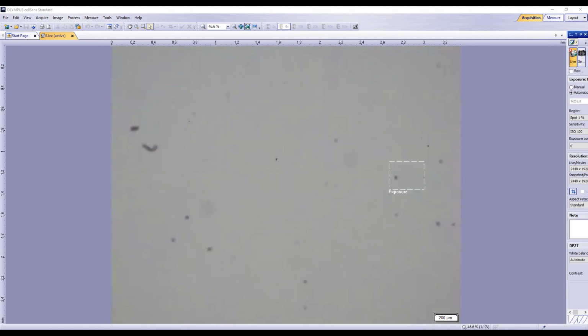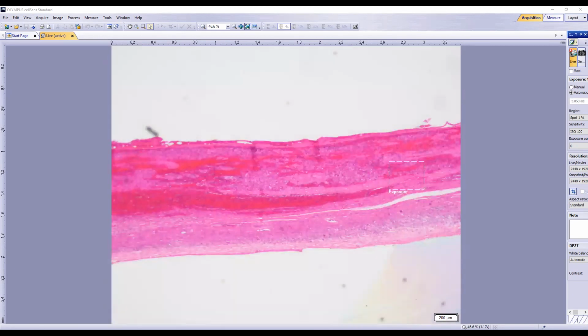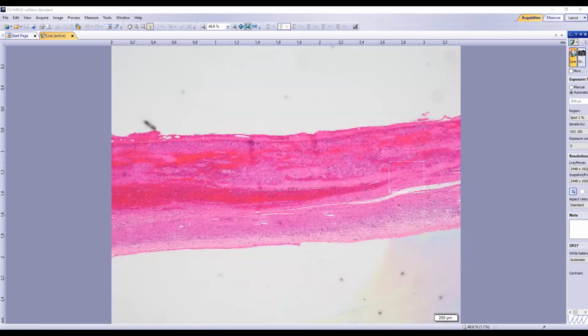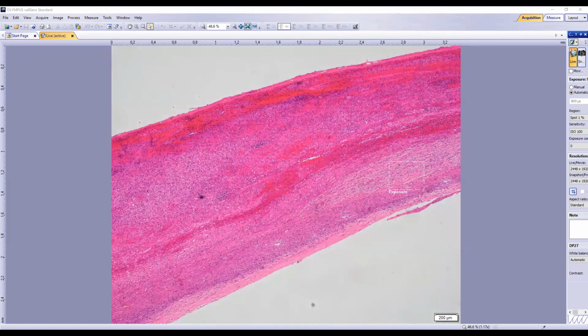So this other cyst, again, you have to just take my word for it because it's actually not in the pancreas, but I'm still using it because you can see something similar in the pancreas. So, a 35-year-old female with a 5 centimeter cystic lesion in the head of the pancreas. And so this is what I have. The cyst is somewhat thin walled.